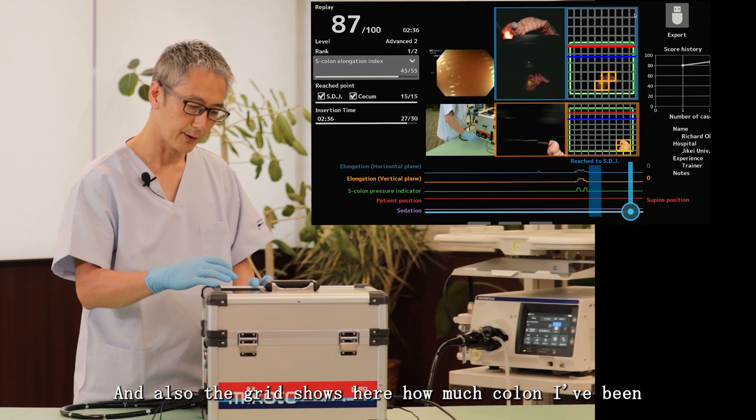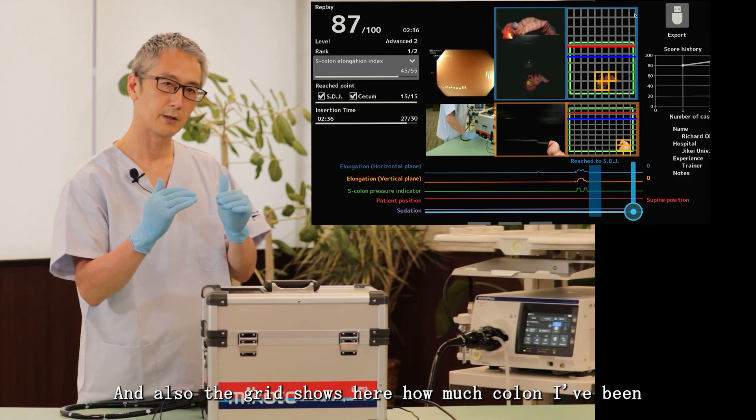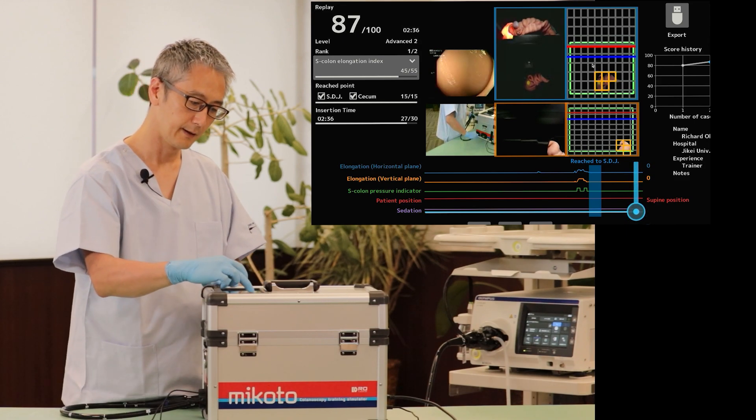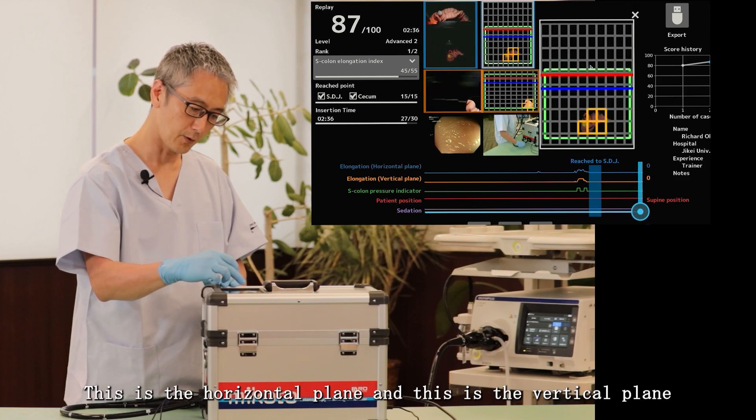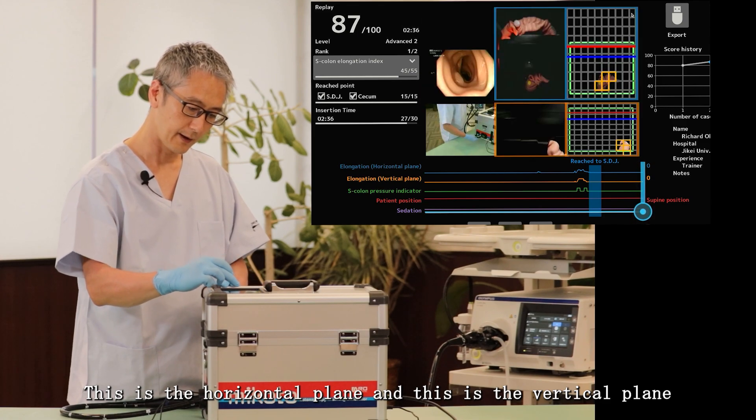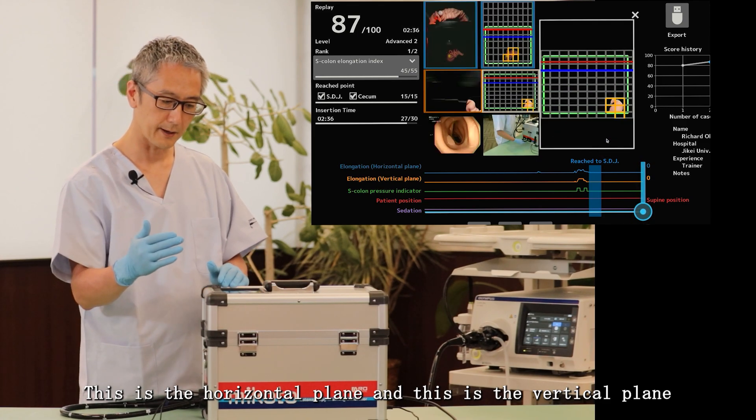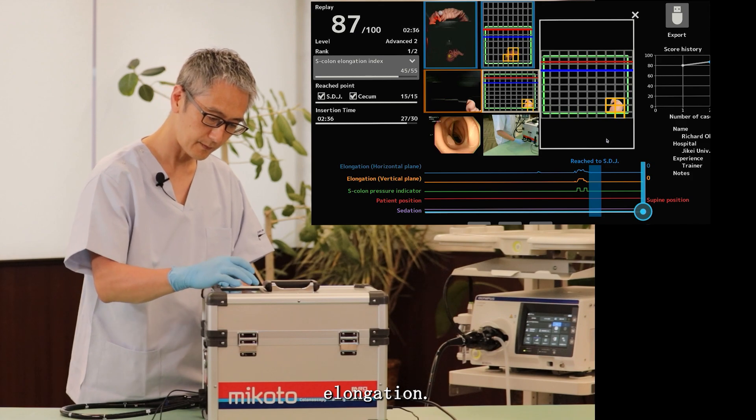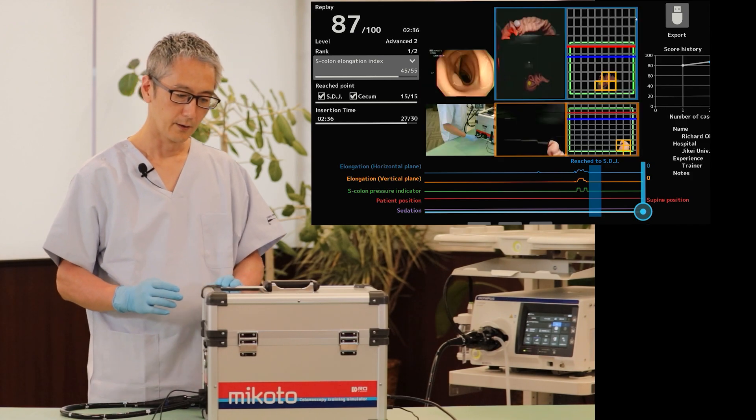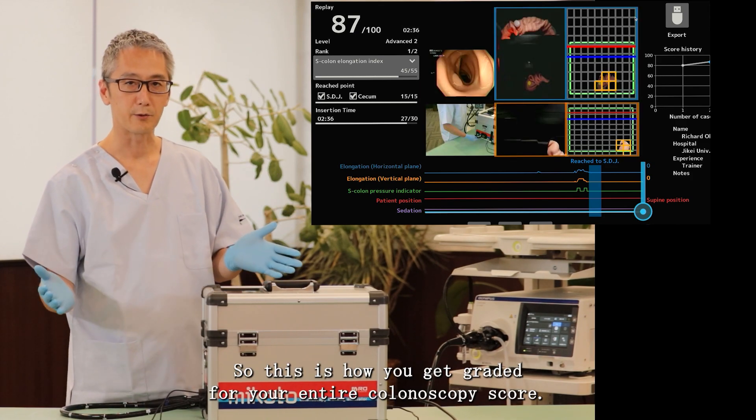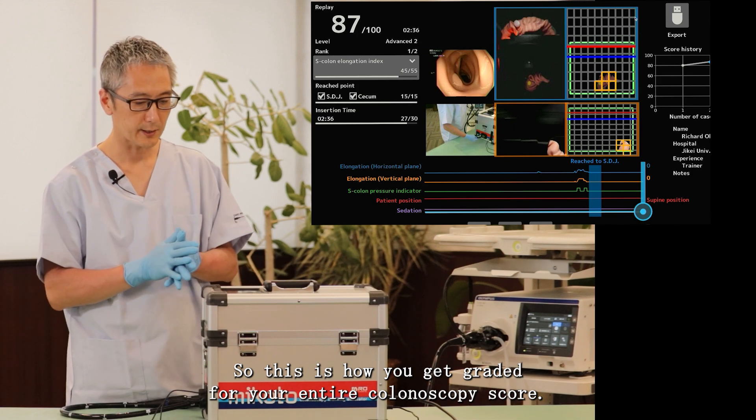And also the grid shows here how much colon I've been stretching out. This is the horizontal plane and this is the vertical plane elongation. So this is how you get graded for your entire colonoscopy score.